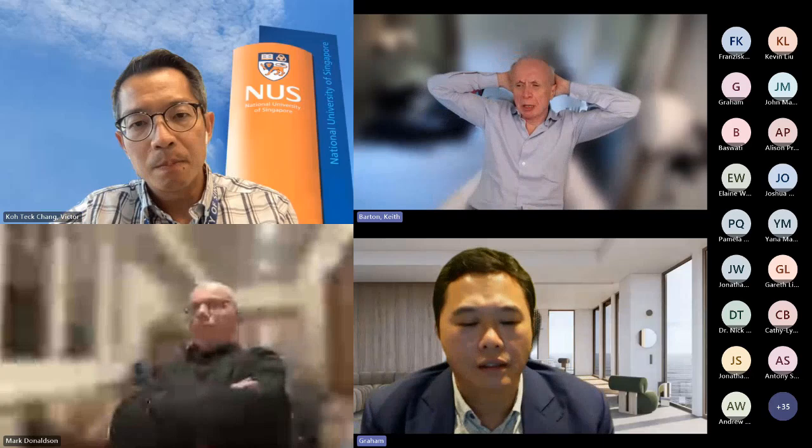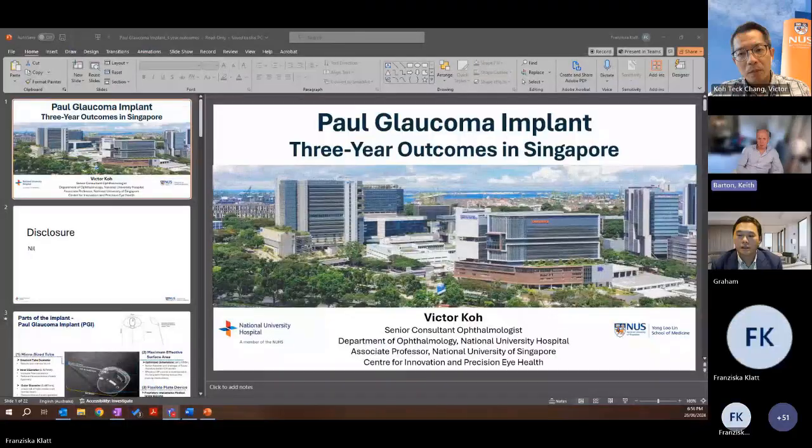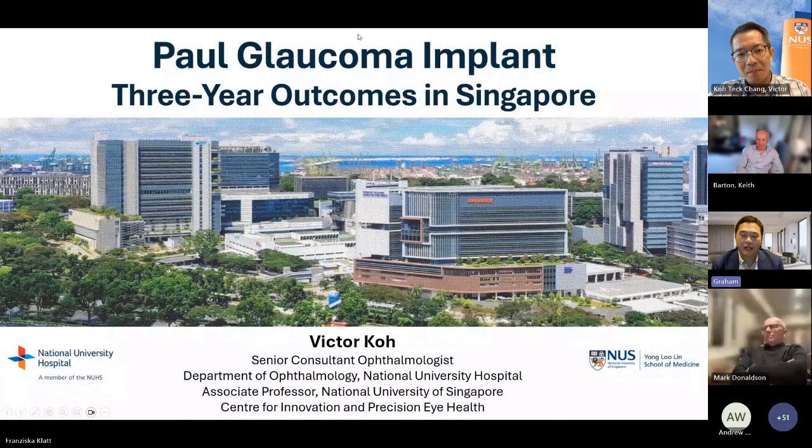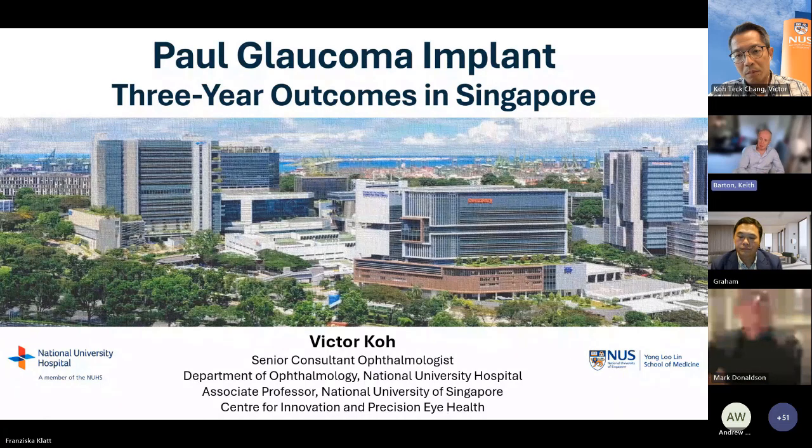Yeah. Graham, can I ask one thing? So when Victor's getting it, how do you manage to flush it whenever the Prolene's already in it? That intrigued me. You mean flush the tube? I actually haven't had to flush a Paul tube. I've certainly flushed Baerveldt tubes, but haven't had to flush. Do you not flush them routinely to remove static and ensure that you get all the air bubbles out and stuff? Well, I put the Prolene down and then I prime it. Yeah, that's what I mean. How do you manage to prime it with the Prolene in? They're quite difficult. Down, and I make sure it goes down so there's no bubbles.